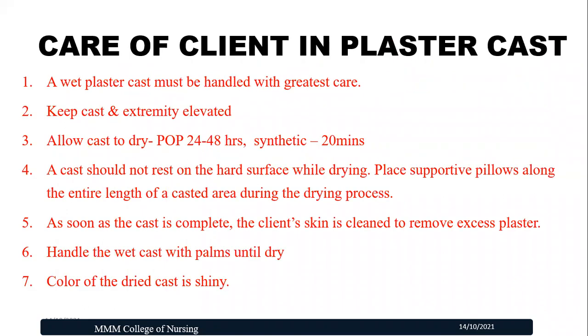Next, we'll see how to take care of the client in plaster cast. Once the cast is set and dried completely, we need to remember some points in taking care of the plaster cast. When the patient is admitted in the hospital, we need to carefully do these things. Suppose the patient is getting discharged with the POP, we need to teach these points to the patient. If available, written material, that is a pamphlet or leaflets, can be given to the patient.